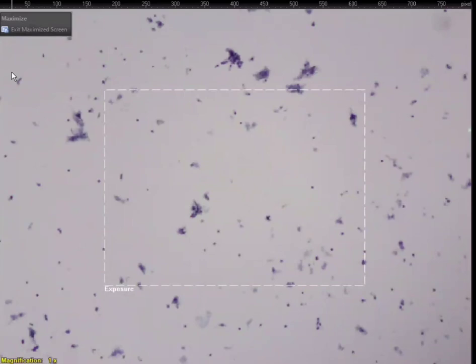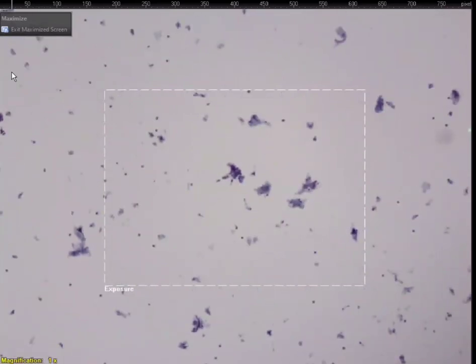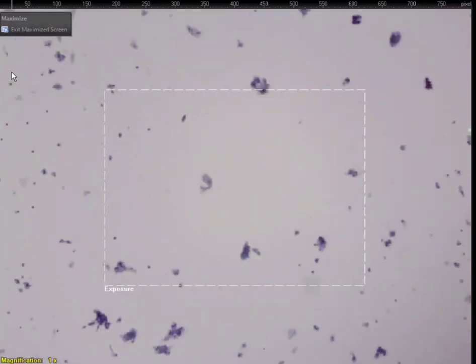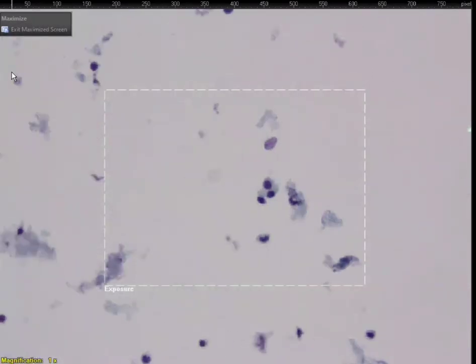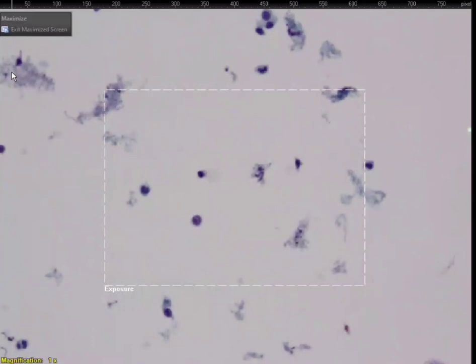Okay. So now it's going to be more tricky because we have lung epithelium, and it's going to be tricky. Did they get a lymph node? Were they in the lymph node? Really? That's the other question now. We have so much contamination. Were we even in the lymph node? Right? That's another thing. So are these lymphocytes?